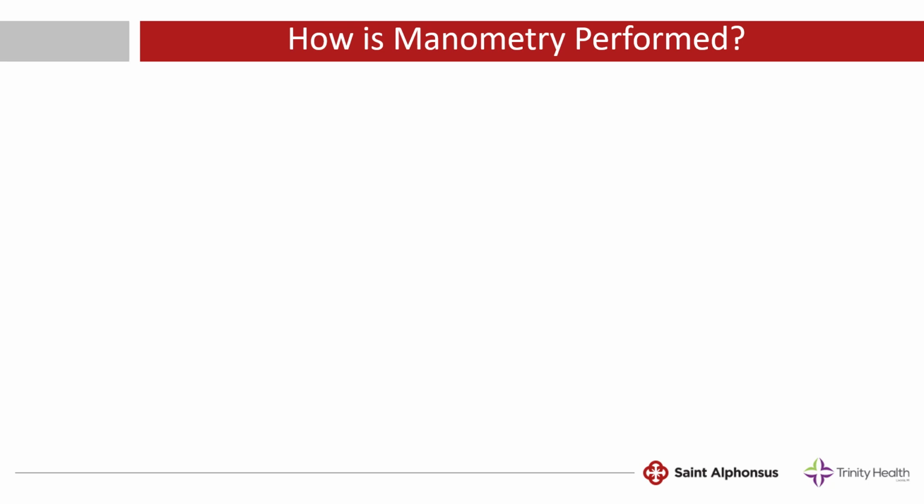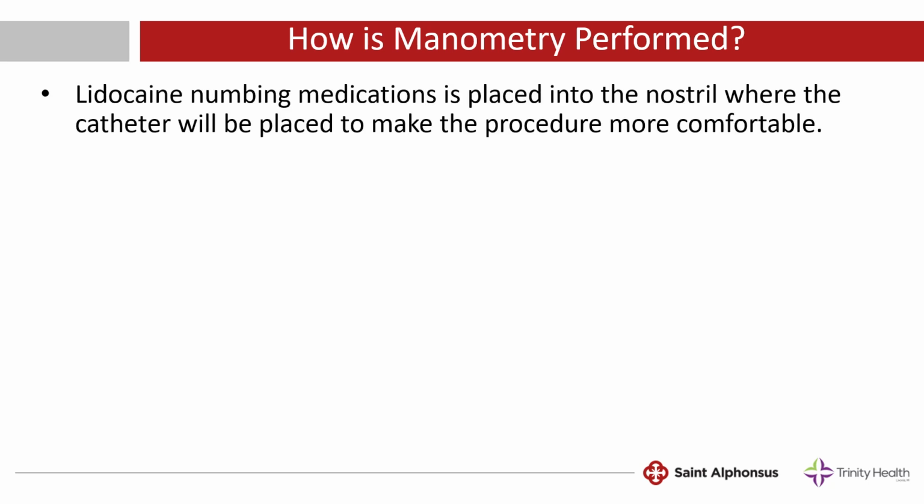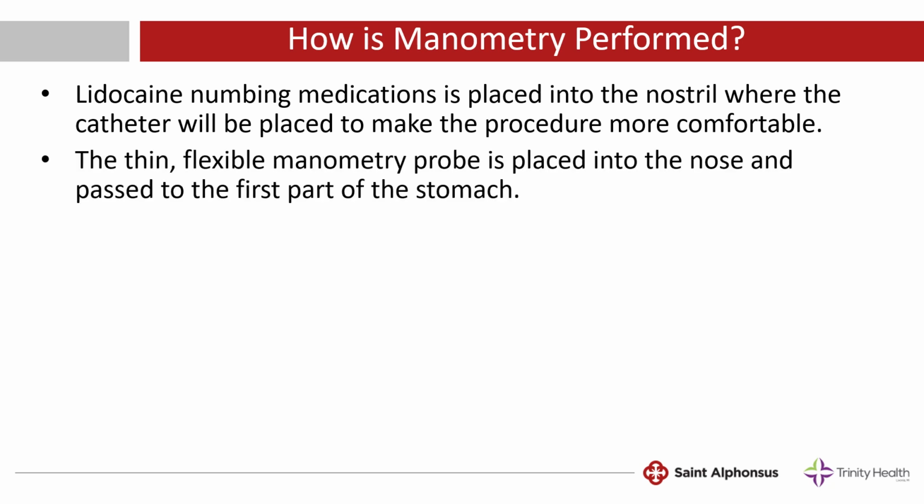Well, how is manometry performed? Well, after you arrive in our office, our nurse will put a lidocaine gel numbing medication into your nostril where the catheter will be placed in order to make the procedure more comfortable. Next, a thin, flexible manometry probe about the size of your iPhone charger cable is inserted into the nose and passed to the first part of the stomach.